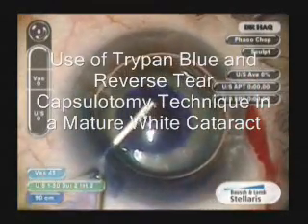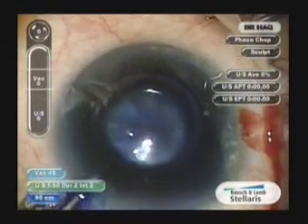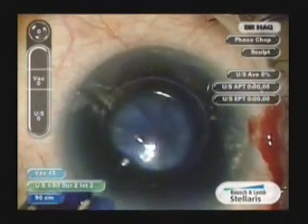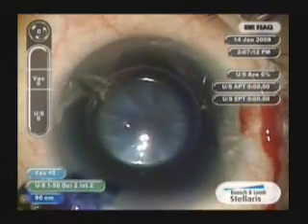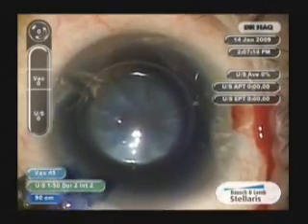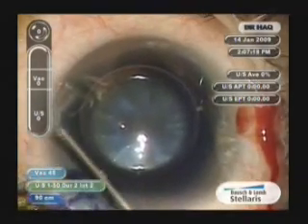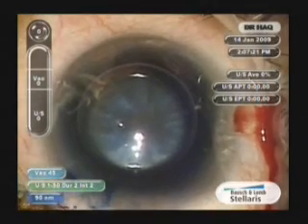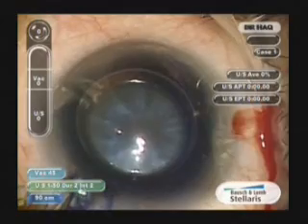This recording demonstrates a capsulotomy over a mature white cataract utilizing Trypan Blue. The Trypan Blue is put in under an air bubble to achieve maximum staining, and then the air bubble and excess Trypan Blue will be removed with viscoelastic.